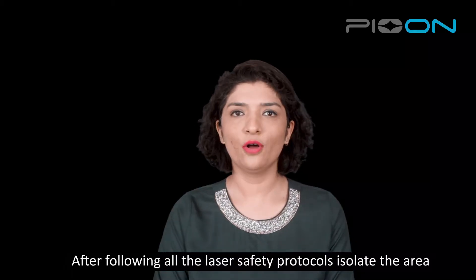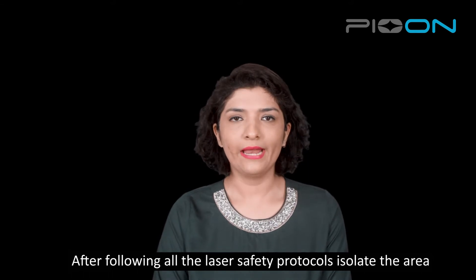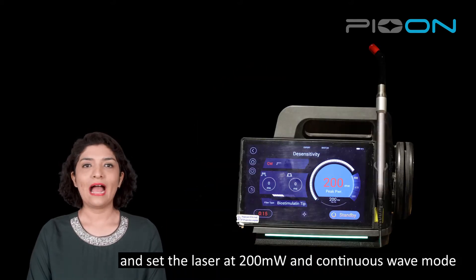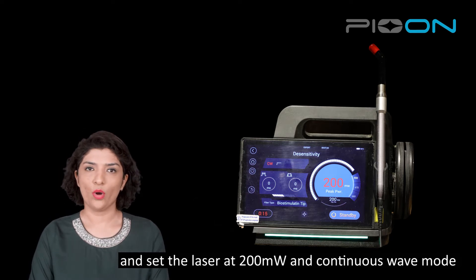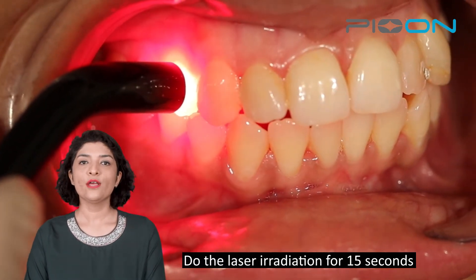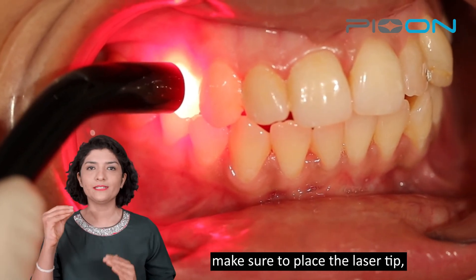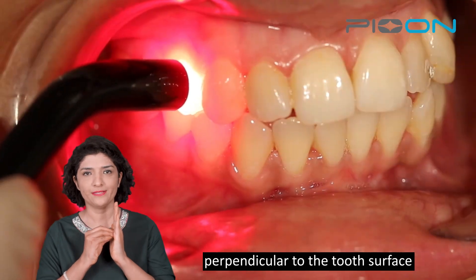After following the laser safety protocols, isolate the area. Set the laser at 200mW and continuous mode, and you will do the irradiation at the following settings for 15 seconds. Make sure to place the laser tip perpendicular to the tooth surface.